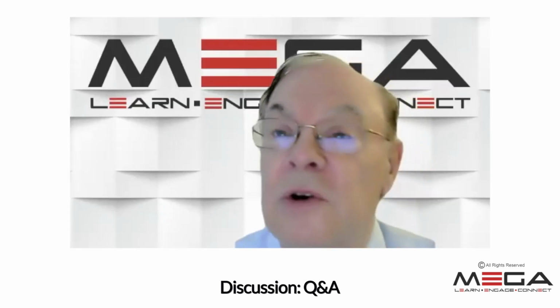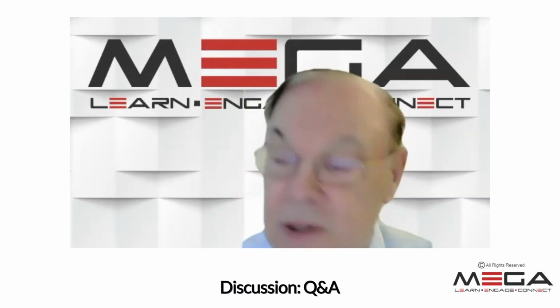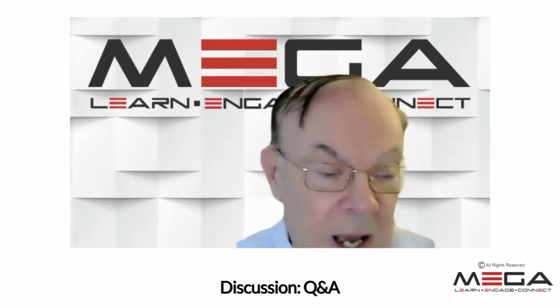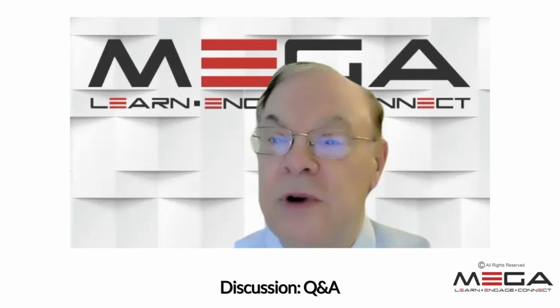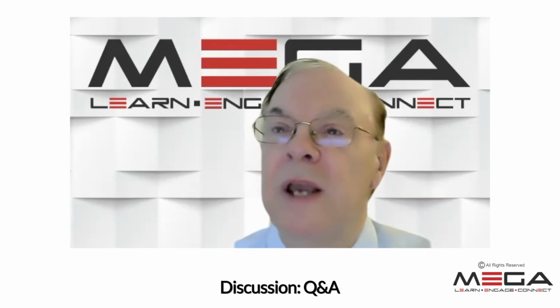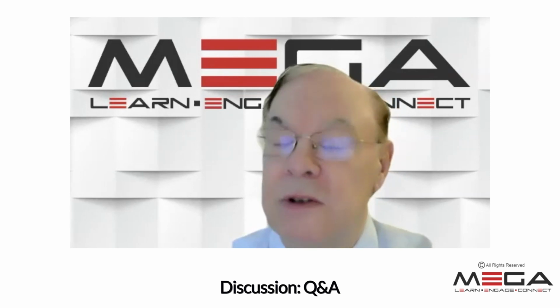So here, as I understand your question, because unfortunately the message was kind of being broken up, and I didn't receive it that well. But if I understand the question, it's about the use of the airway exchange catheter. The airway exchange catheter is inserted just prior to extubation, into the endotracheal tube. And then the endotracheal tube is removed over the airway exchange catheter and taped in place. There are markings on the airway exchange catheter so that you can be sure that you are not too deep, because you don't want to be touching the carina. And then you keep an eye on the patient's spontaneous breathing to ensure that they are not failing.